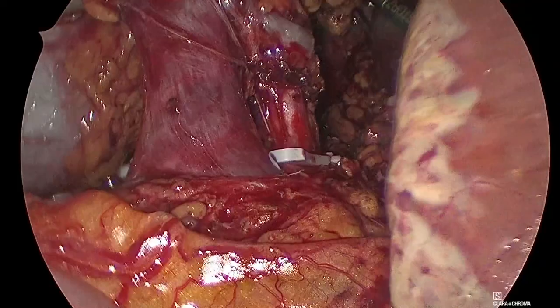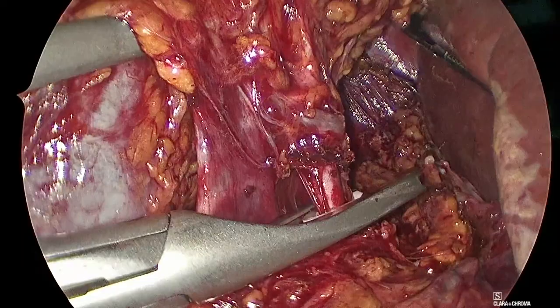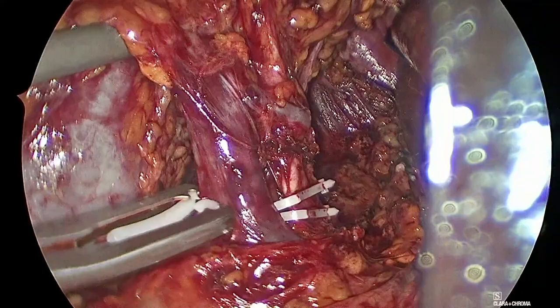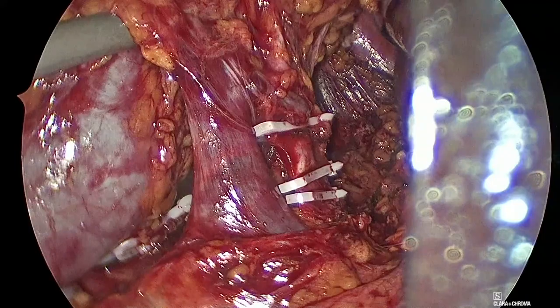Okay. Come back. So one thing that is nice is that at times, if you have difficulties, you just place a clip on the artery, you cut the vein, and then you go back to the artery. So in this situation, I think we're safe enough. We placed two Hemolocs on the stay side, and then we'll place another Hemoloc on the kidney. And I think that's more than enough. So no, ultrasonic scissors, I have it. So give me scissors.